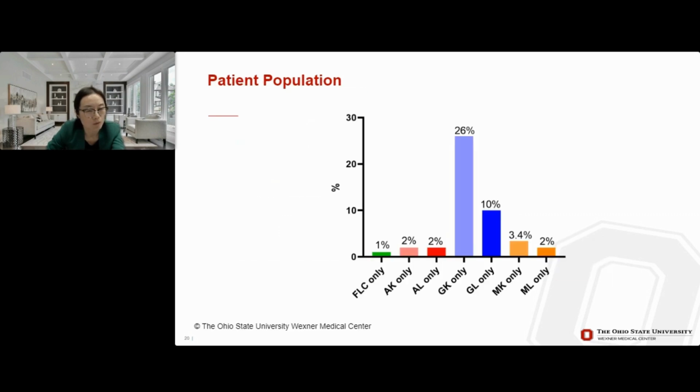To determine the workflow in each lab, the first question is how many serum samples you need to be confirmed on the gel electrophoresis. Like what I mentioned in the previous slide, we have about 5 to 10% serum samples reflexed on gel, which is affordable workload and turnaround time in our lab. Then the next question is, what is the patient population in your institute?